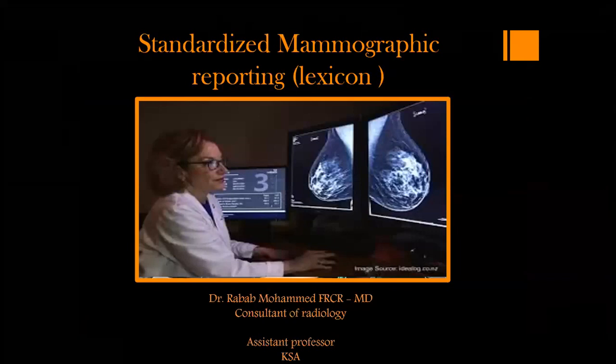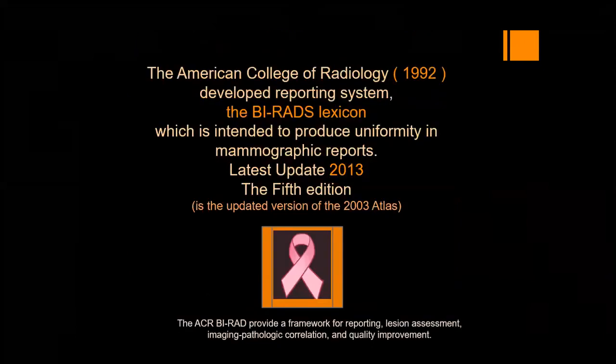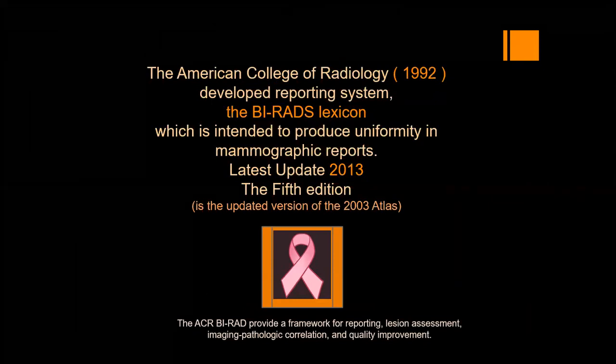We are going to continue standardized mammographic reporting based on the BI-RADS lexicon. As you know, the American College of Radiology developed the reporting system in 1992 for mammography, and in 2003 included breast MRI and ultrasound, and updated in 2013, the latest 5th edition.